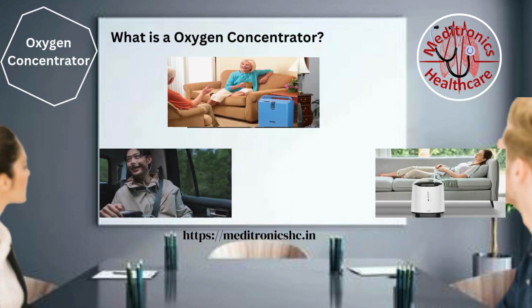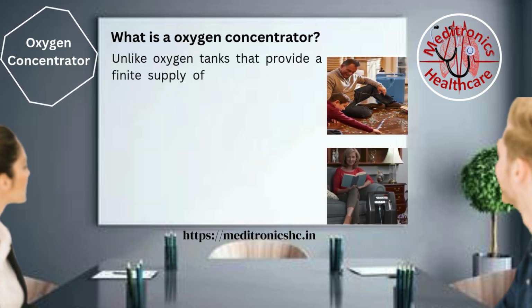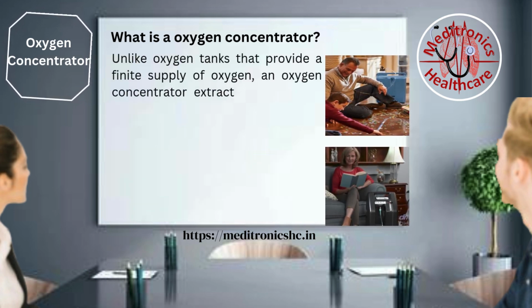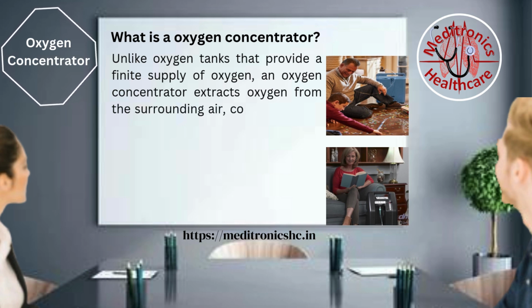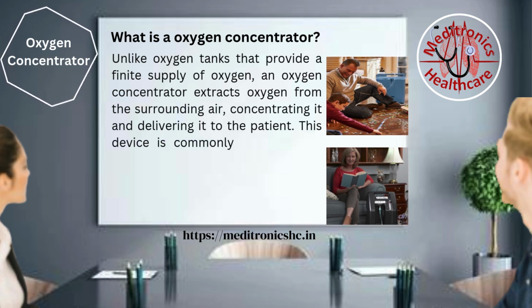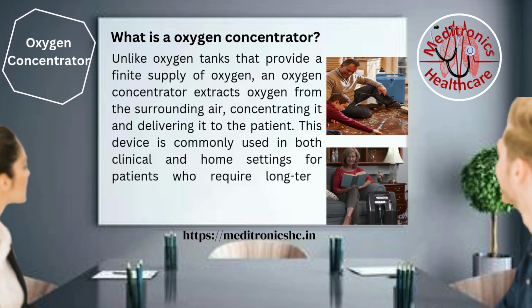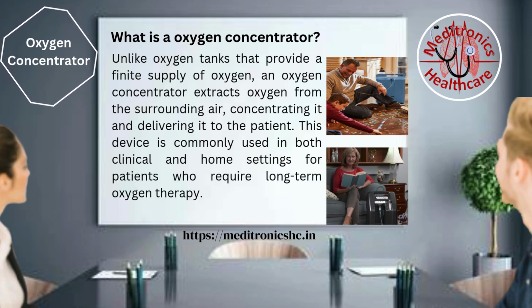What is an oxygen concentrator? Unlike oxygen tanks that provide a finite supply of oxygen, an oxygen concentrator extracts oxygen from the surrounding air, concentrating it and delivering it to the patient. This device is commonly used in both clinical and home settings for patients who require long-term oxygen therapy.